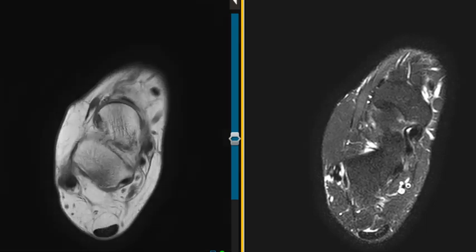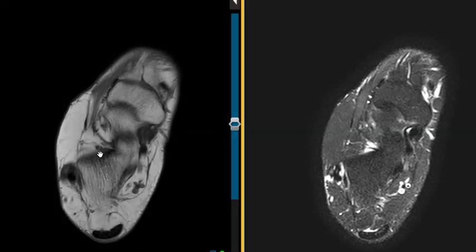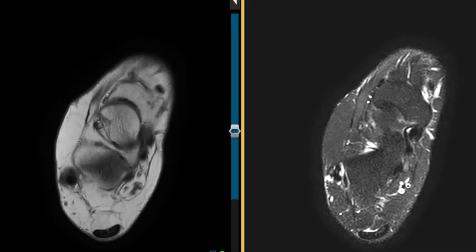It's very common to see in the foot and ankle loculations of fat. They look just like lipomas. They can be pretty clean. And so we really don't mention fatty collections as lipomas in the foot and ankle. And we see these things all the time.